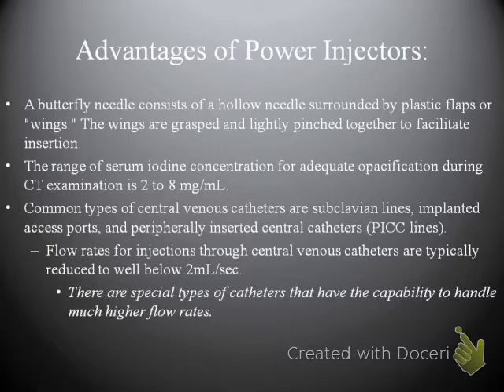Typically, butterfly needles are used for things such as the CT of the head, in which a power injector does not necessarily have to be utilized. The range of serum iodine concentration for adequate opacification during the CT examination is 2 to 8 milligrams per milliliter of fluid injected.